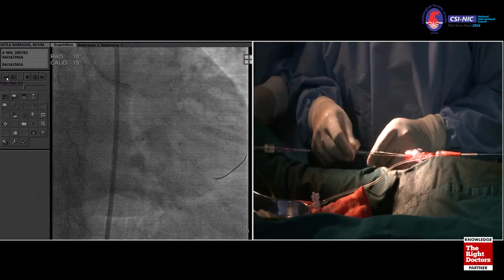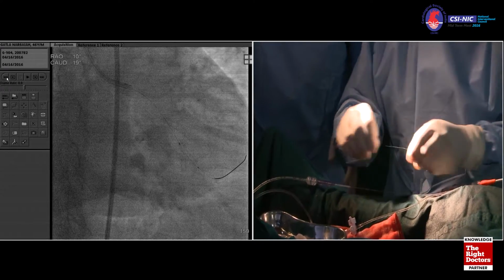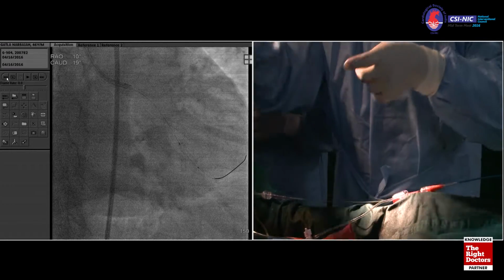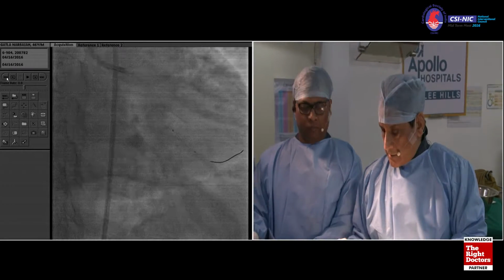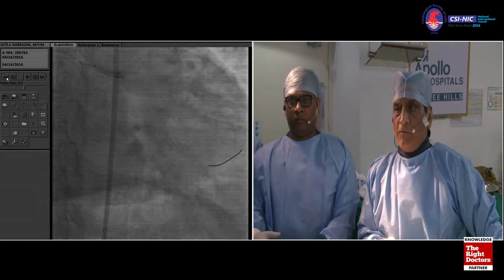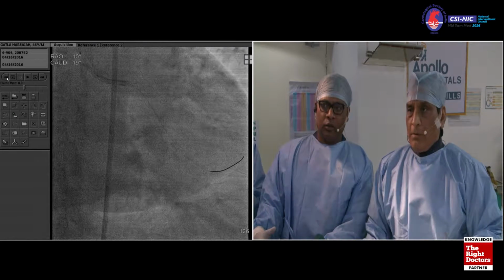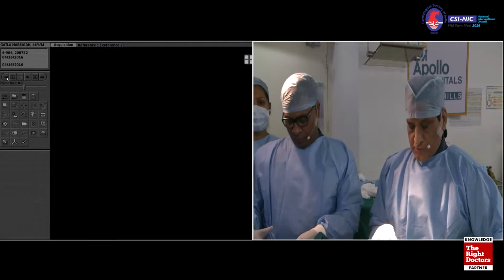Distal to the stent, there is also a lesion. Okay, now let's see what we have. Yeah, we might end up using the same, like earlier we needed a Fielder wire. So we bring this, everything should look good. Now before even going, I always do just fluoro, and it will tell me how much stent we have crushed. Usually because of the angulation, sometimes you end up putting a crush of the more, but the idea should be that you do a mini crush. Let's take one picture and then maybe stent boost.